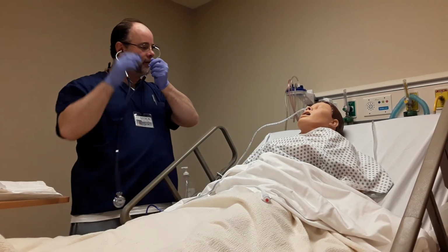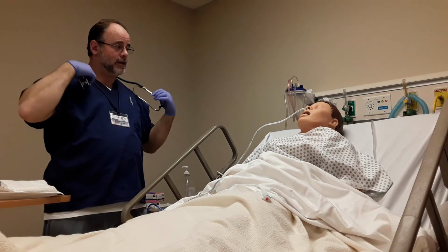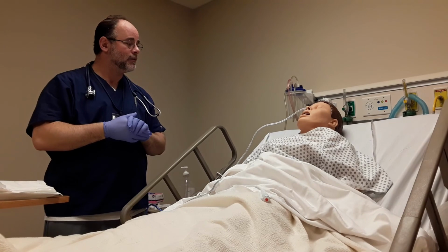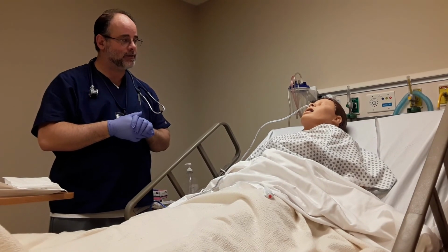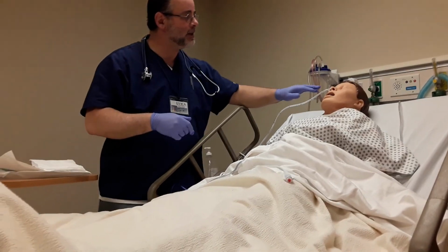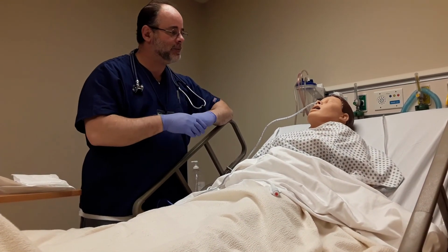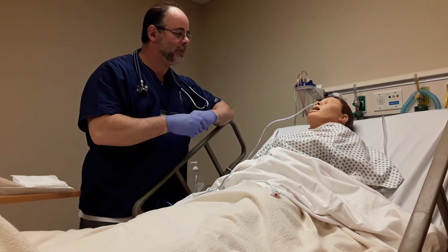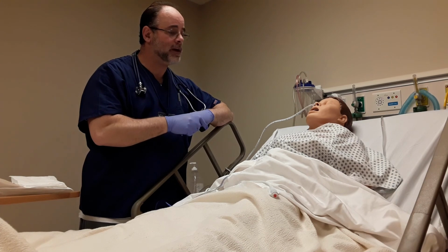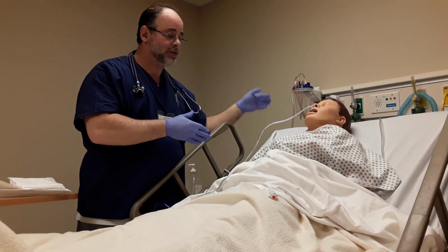Okay, so the remaining indicator would be having the patient go down for a chest x-ray to verify placement through that process, and we have done that, and he is back on the unit, and I checked to see that he is at 55 and that he's comfortable. He's back in his bed, and the x-ray has come back as being in place, so then we can further help the patient with whatever orders doctor has from here on out. We're ready for suction if needed.